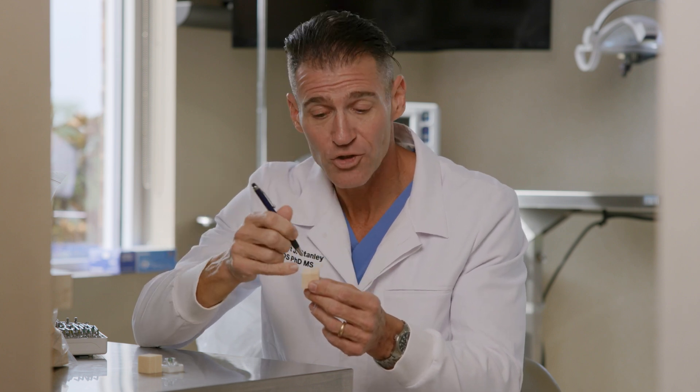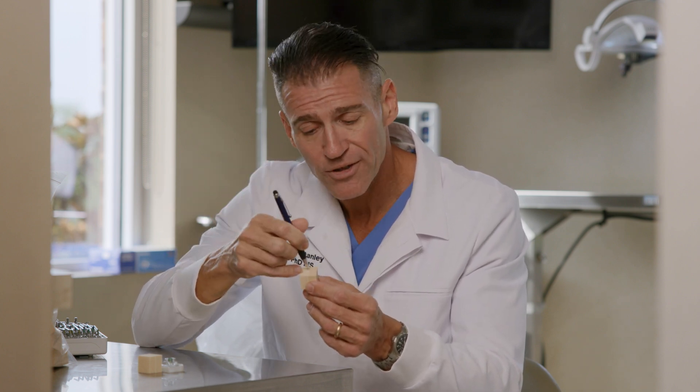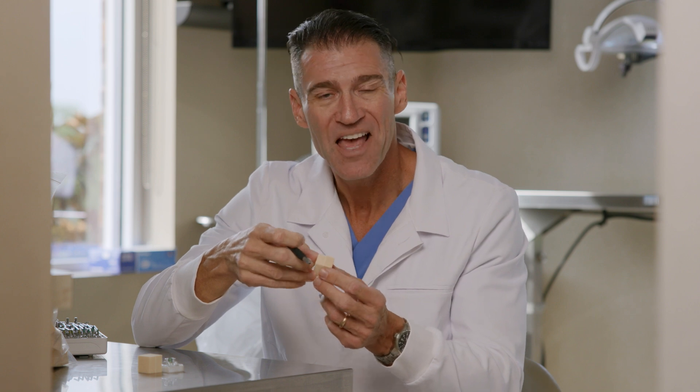We're going to do a drilling protocol twice. The first time we're going to drill without a guide and try to place the hole right in the center of the cube — it couldn't be any easier because you can clearly see where the center is. Then we're going to do it again, but the second time with a surgical guide. Let's see how it goes.